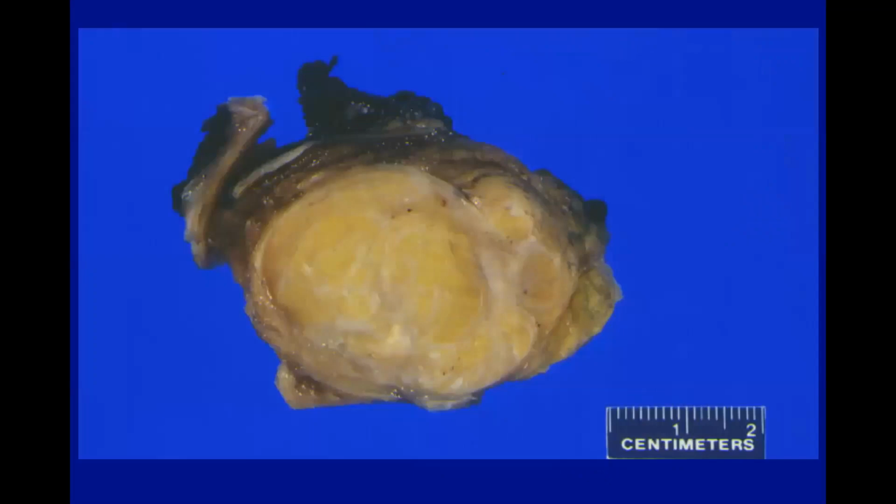Okay, so gross characteristics of these tumors, again, there are no absolute features that help establish this diagnosis, but we do look for things that should cause you concern and make you think about sampling this to a greater extent. If you look at this tumor, it's largely composed of yellow, mature, fatty tissue, but it's intersected by strands, variably sized strands and septa of this kind of white scar-like tissue. And when you see this type of phenomenon, this should alert you to the fact that this could be something more than simply a lipoma.